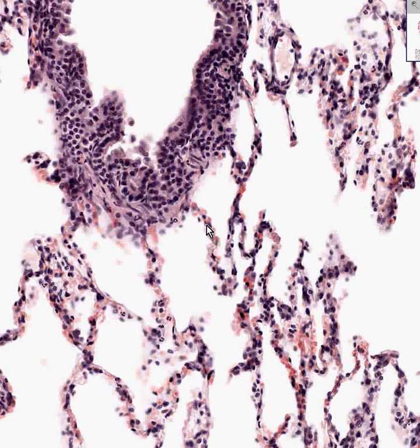Here are actual alveoli, and here is the wall of an alveolus, and you can see all of these little red things stippled in the alveolar wall are actually capillaries. Otherwise, the wall of the alveolus consists of pneumocytes, both type 1 and type 2, as well as an occasional macrophage.